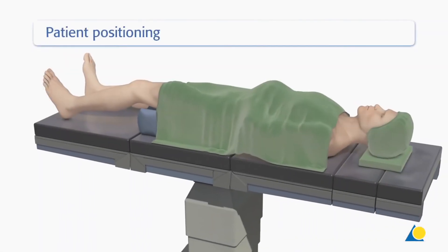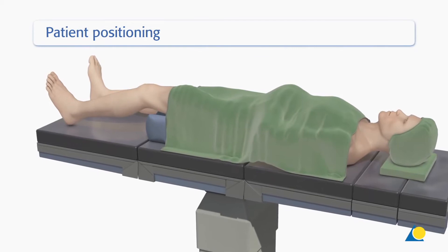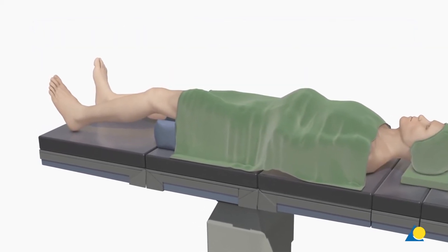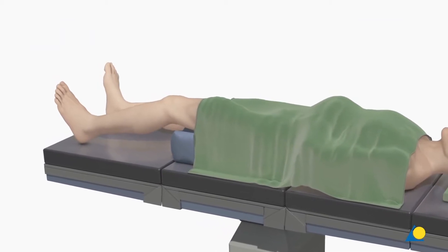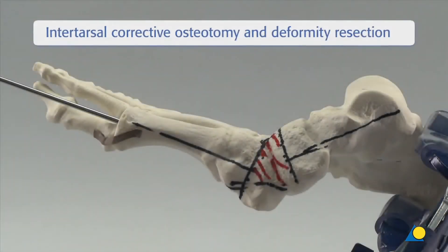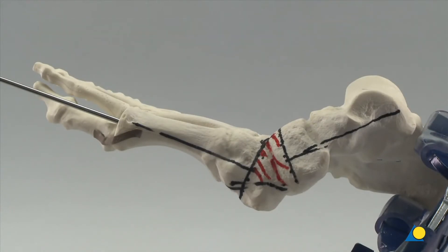The patient is positioned supine on a radiolucent table with a bump under the contralateral hip to facilitate visualization of the medial side. The 2.8 mm guide wire is inserted retrograde from the first metatarsal head to the first TMT joint, following the axis of the medial column.